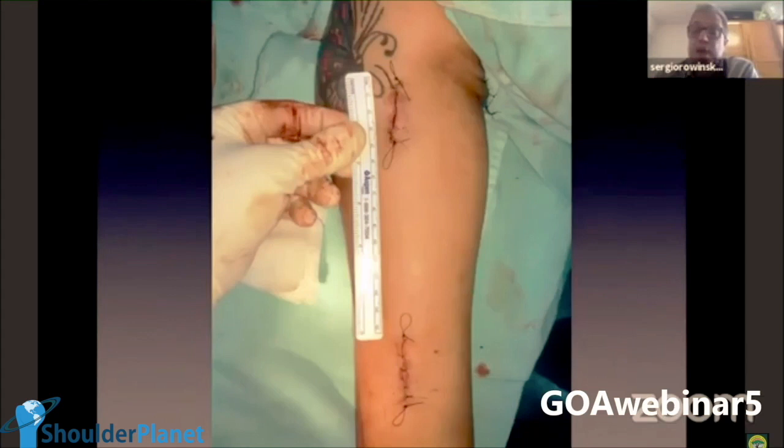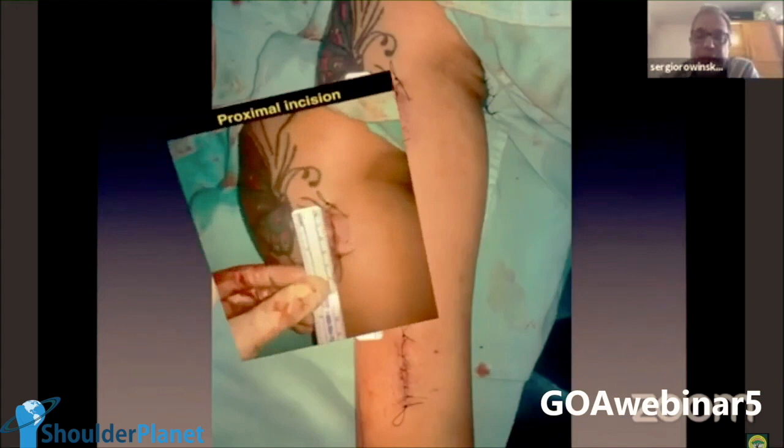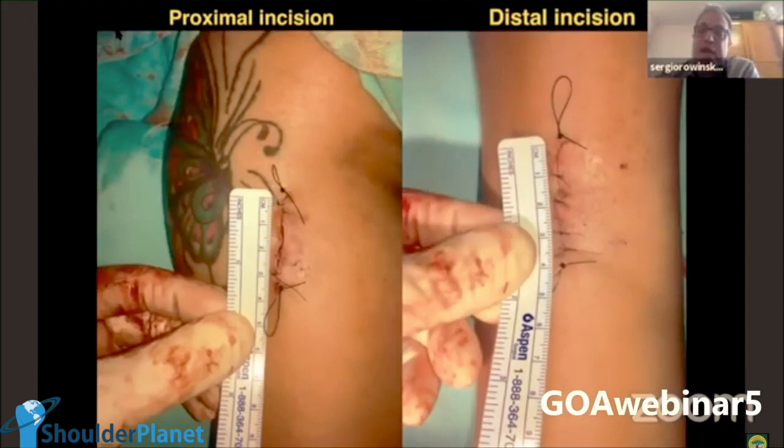But what about the sizes? As a rule, I don't care about the sizes, but in the last 10 years the proximal incision has been around 3 centimeters, or 2.5, and the distal incision about 3.5. But for some skin reasons that I don't understand, and I don't care about it, this distal incision shrinks with time in a way that it becomes very, very small, and I'm going to show it soon.